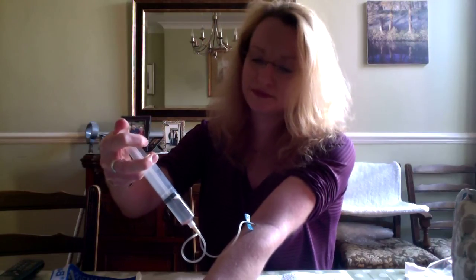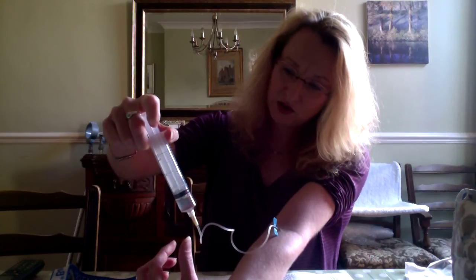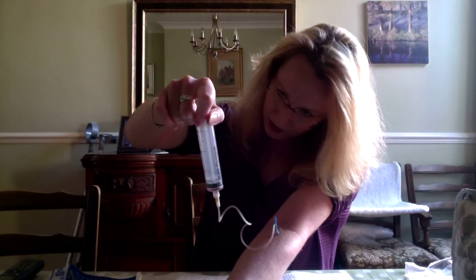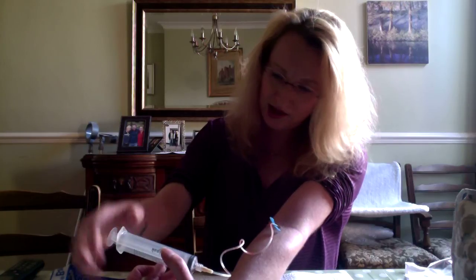And that, as they say, is that. People inject these things at different speeds. I generally inject it as quick as I can because I don't want to be hanging around doing this all day, and generally I believe it doesn't really make a big difference. I haven't had many reactions to doing it too quickly — I have had allergic reactions but that was different. Basically what I'm trying to do is get every little bit of liquid in there. It doesn't matter if the blood goes back in — that doesn't matter, it's all very useful. So I'll just keep going and watch basically where the air bubble is. I'd rather stop when that gets to there, so that's what I will aim to do.